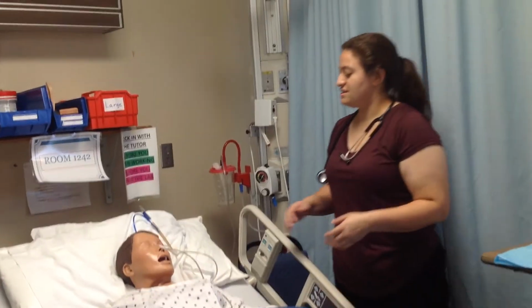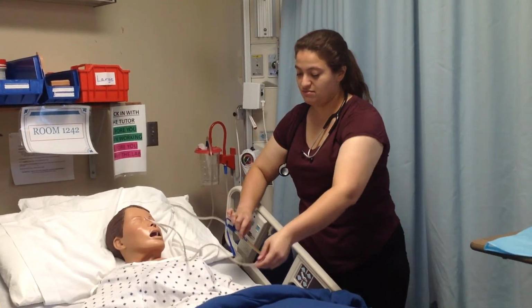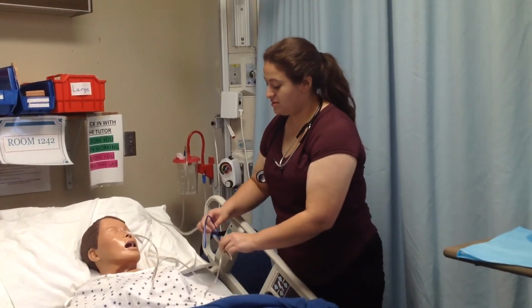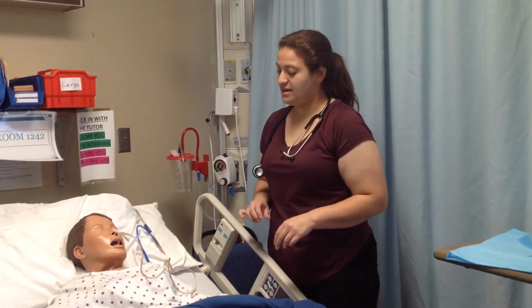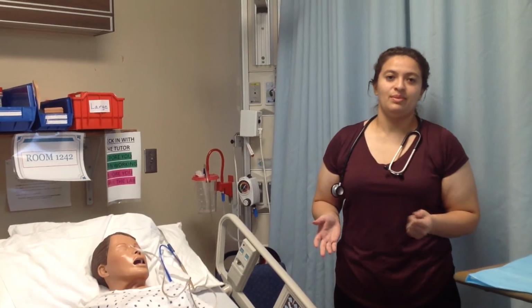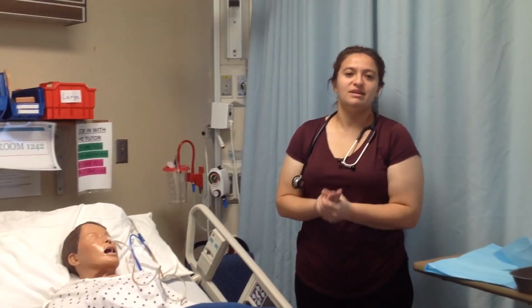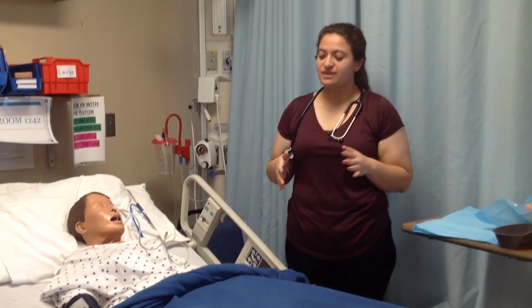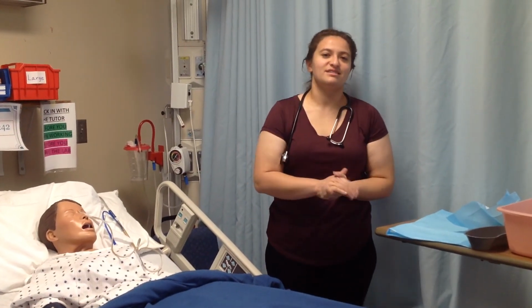And then I would ask the patient if they're comfortable, is there anything that they need. Make sure that the tubing is in a comfortable space for them. And I would make sure to keep it up above the abdomen, as I mentioned. And then I would perform hand hygiene and exit the room. I want to make sure that I properly dispose of everything. And then, again, perform hand hygiene and exit the room.